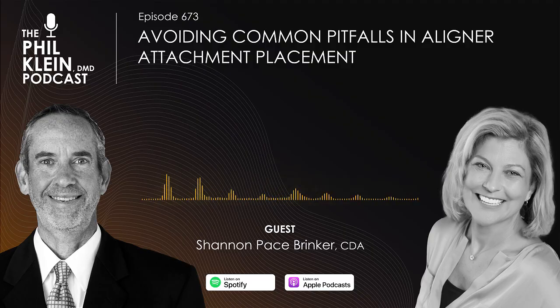Otherwise, you're not going to be able to generate the shape and the fullness of the attachment that's indicated in the template window. And I assume, of course, Shannon, that you put some pressure on the template once it's seated during the light curing procedure. Absolutely. Because the thing is, it's spongy. This template is very different than the first aligner. The first aligner is a lot more rigid, heavier feeling, but the template is not as rigid. It's a little bit more flimsy. So when you put that composite in there and you go to seat it, it'll sponge off just a little bit of the teeth, almost like putty, and it comes up just a little bit. So we really want to hold it down.